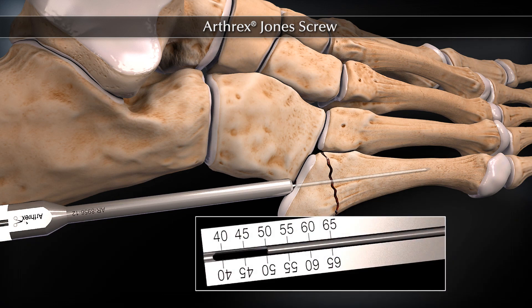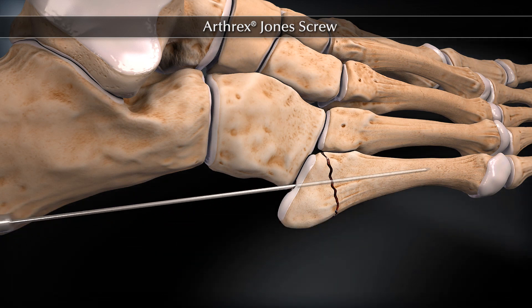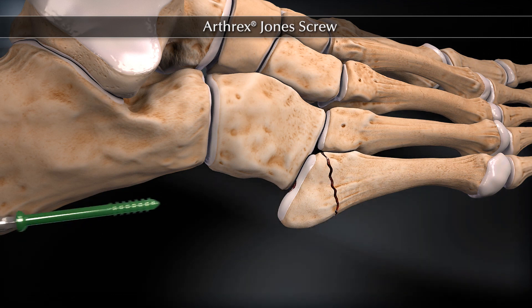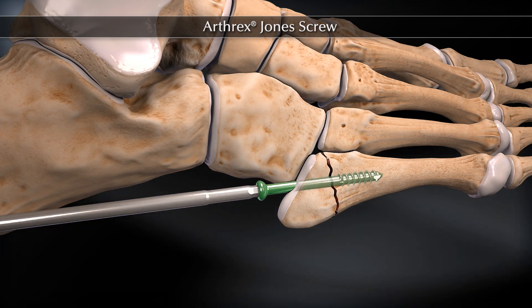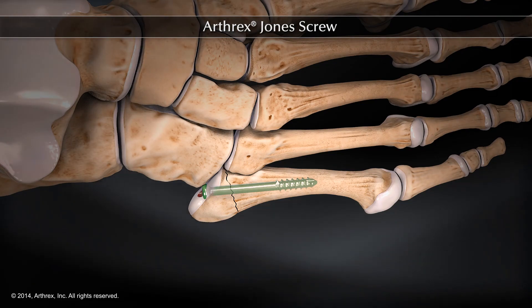Measure screw length from the depth device. Using the driver, insert the appropriate screw until fully engaged.